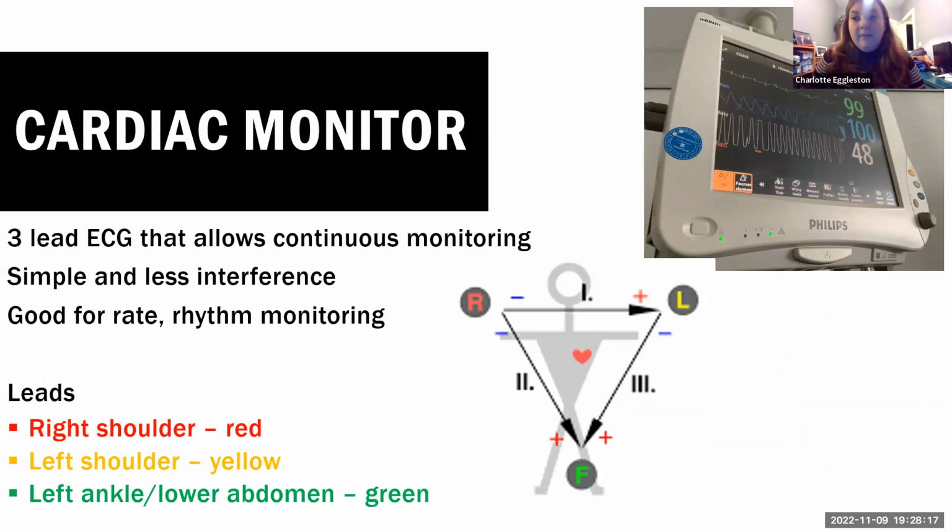You may have seen cardiac monitors on the ward. When people are hooked up to a continuous monitor, we don't have all 12 leads on them, because inevitably the reading would be really rubbish because they get tangled and lots of things interfere. So we just tend to do 3 leads. Similarly, it's ride your green, so it's red, yellow, green, just the 3 leads.